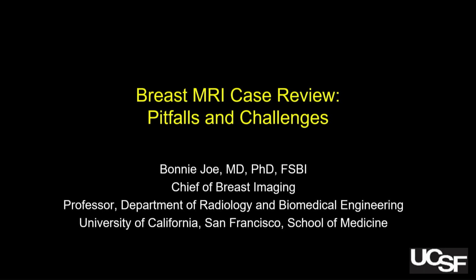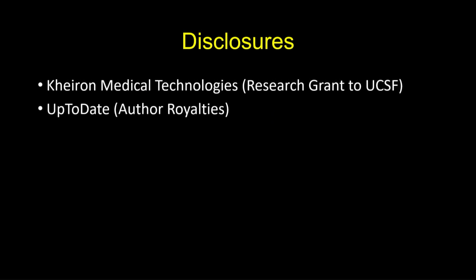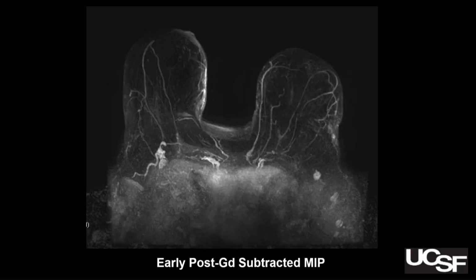It's a heavy afternoon. Thank you all for being here to go through pitfalls and challenges. So another case review, and there's going to be 10 cases, which means in half an hour, it's like 3 minutes a case. So it's a really busy breast MR reading day, okay? So let's just jump right in. And sometimes I'll poll, sometimes I won't. We'll see how it goes. So keep everybody awake and on their toes.